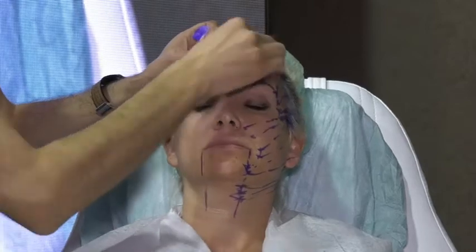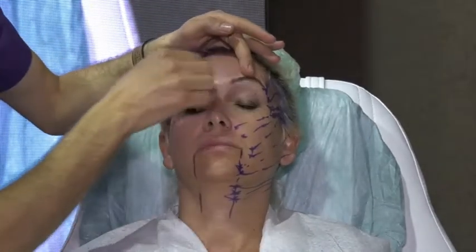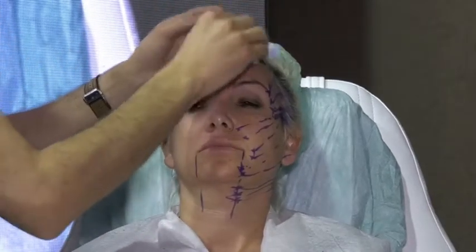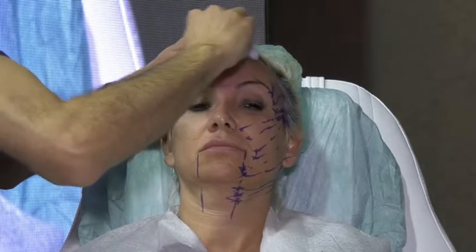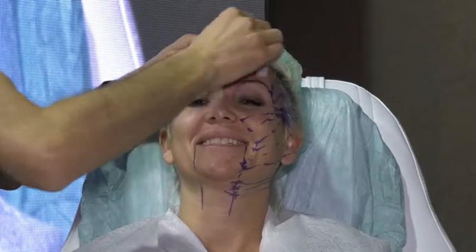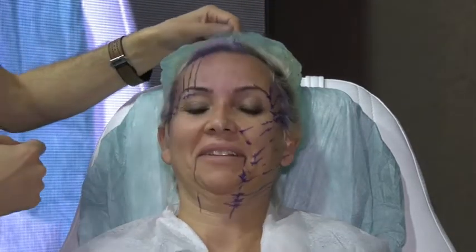The marker is really good, but it's better for workshop sometimes. In your clinic, you can do what you want, but when you are in a workshop, you have to see the clear lines very well. I'm sorry if I'm taking a long time, but this is really the most important part. After this, what will we do? We'll do marking and put the thread under the marking.